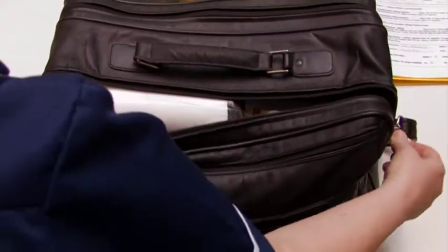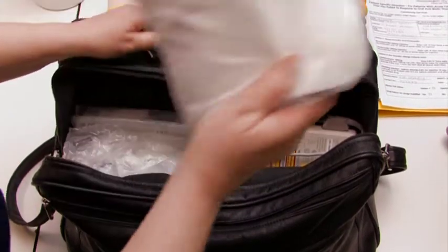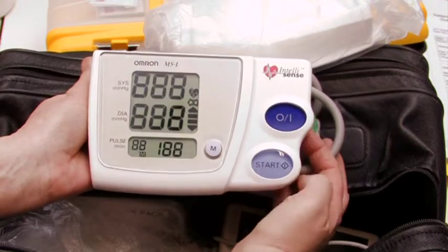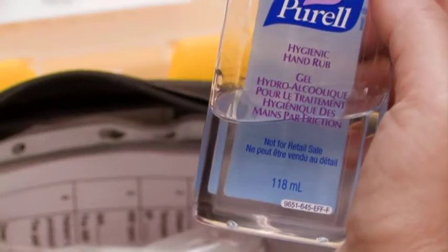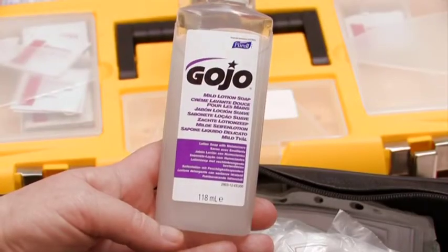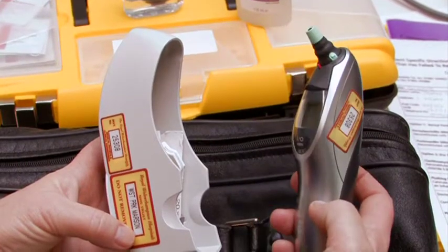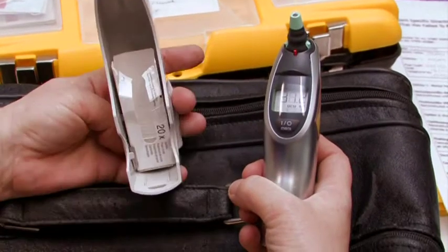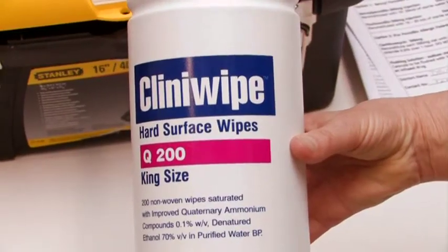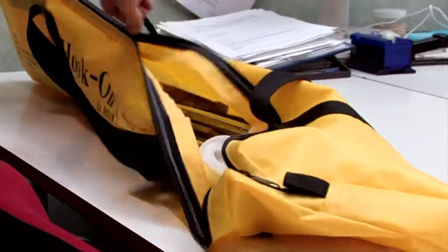The nurses will also take with them a nursing bag, the contents of which must be checked as follows: aprons, blood pressure machine, checking it by turning it off and on, hand gel, hand self-wash, thermometer, again testing by turning on, also checking that there are earpieces with it ready to use. The nurses will also take with them Clini wipes to clean the IV stand, which has been designed especially to easily clean in this way.